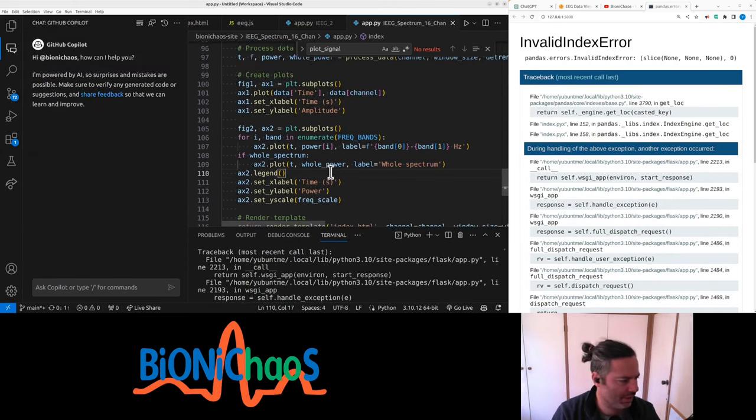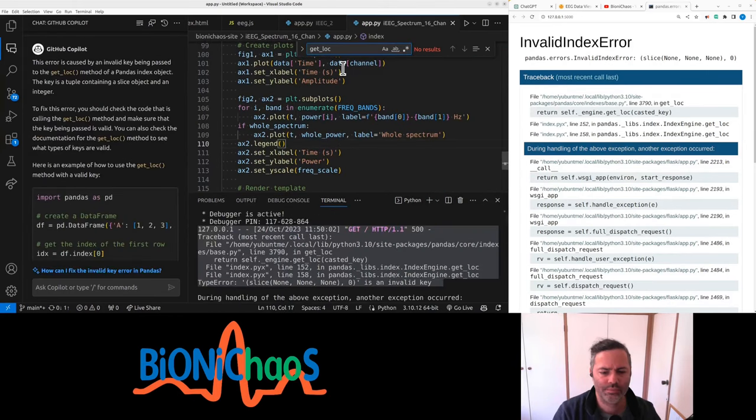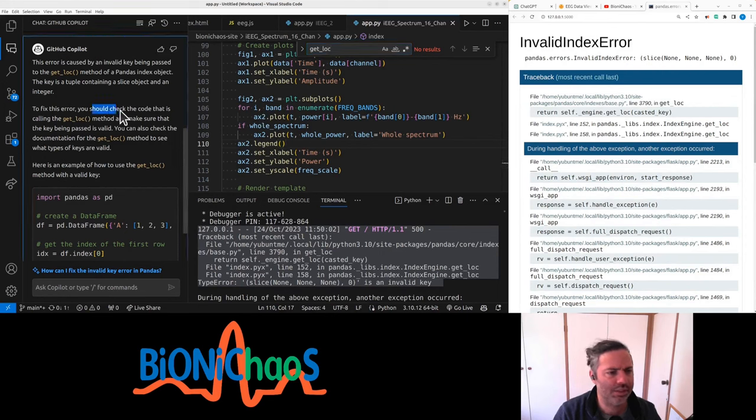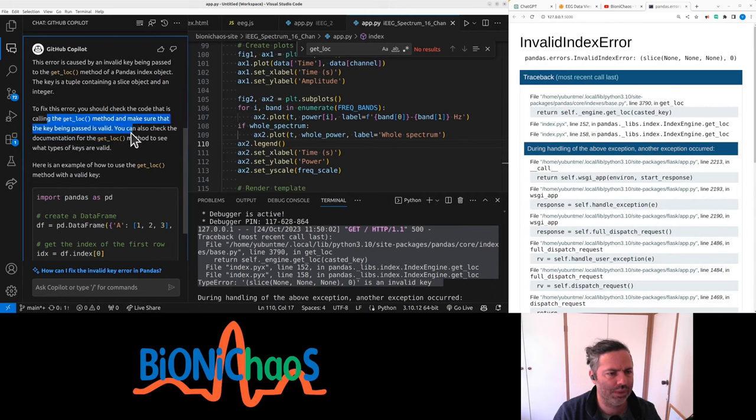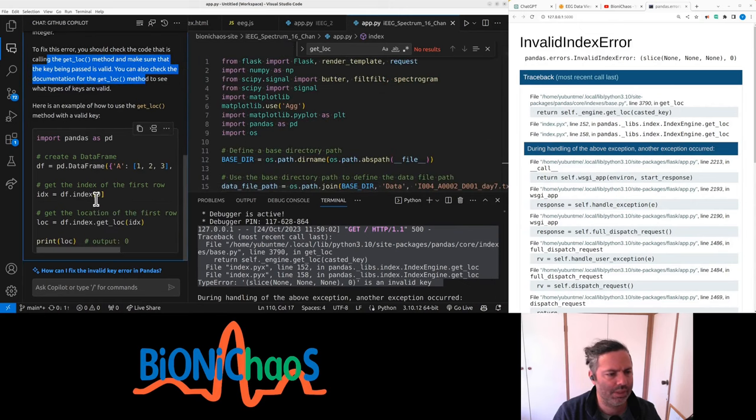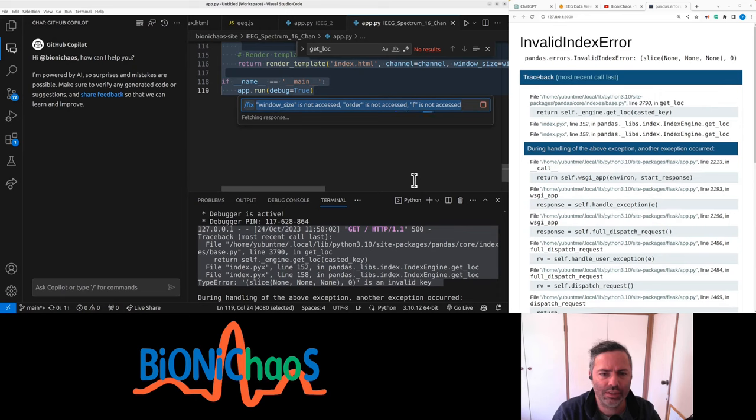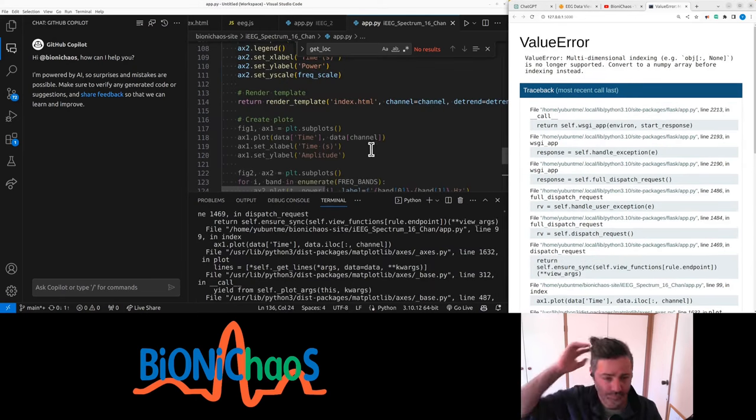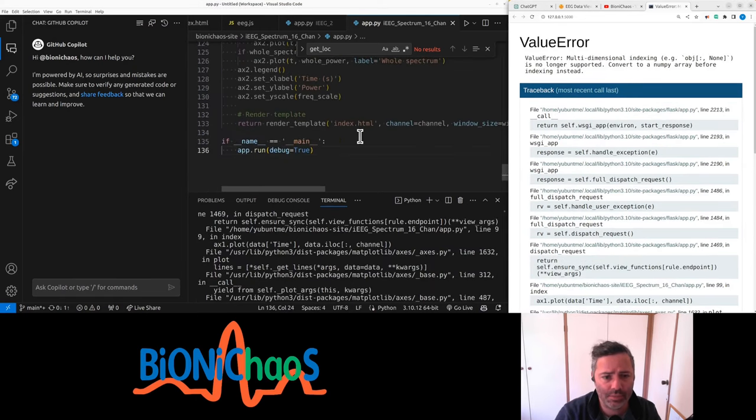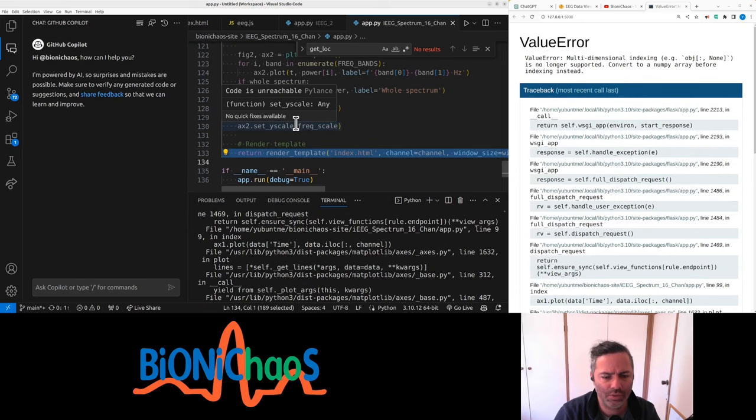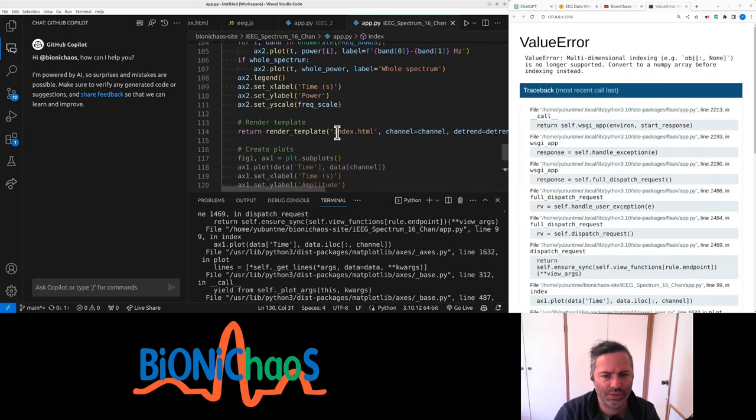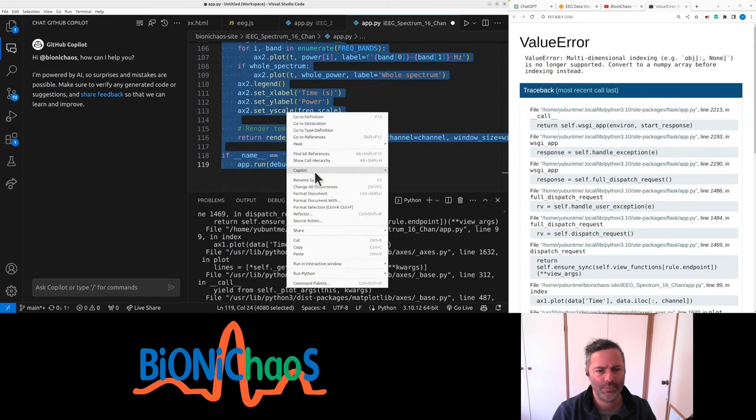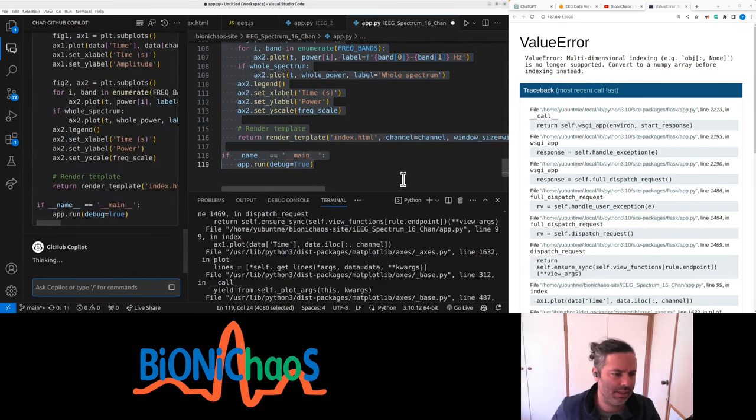Not using getloc. Don't get it. It's there, you should check the code that is calling getloc and make sure that the key being passed is valid. Yeah, we have pandas as pd. I must give it a more specific. Don't get it. To fix this, we're not having a great time. Code is unreachable because the return is there. Code of course is unreachable. Copilot, explain this.